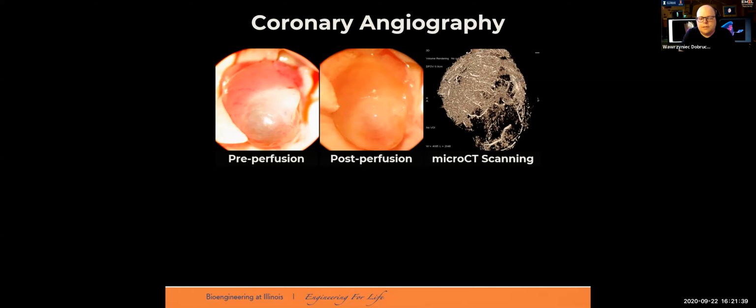So Elizabeth says, why is the penetration energy so high if the mouse is so small? It's a very good question. Because definitely the penetration energy for a mouse, if you're talking about 120 kilovolt energy, which is used in clinics, for example, in human patients, this energy is definitely high for a mouse. High, but it doesn't mean that it's a bad thing.